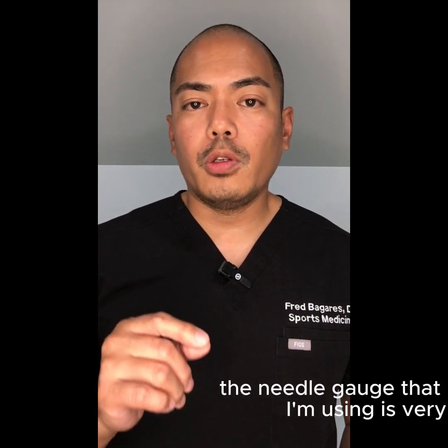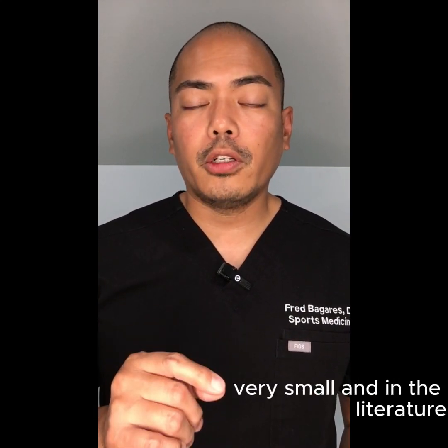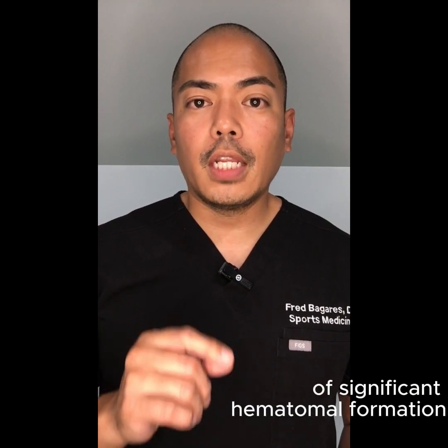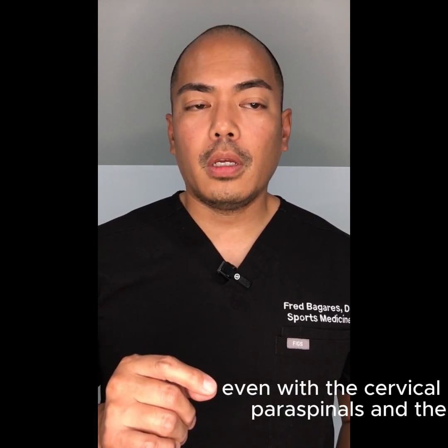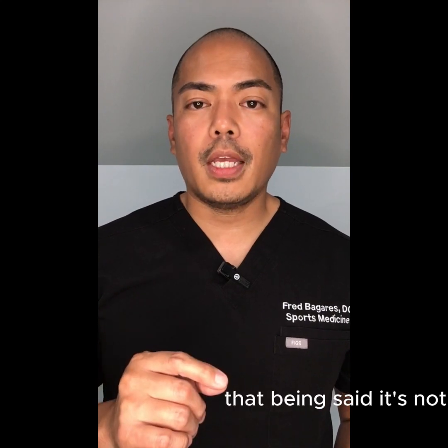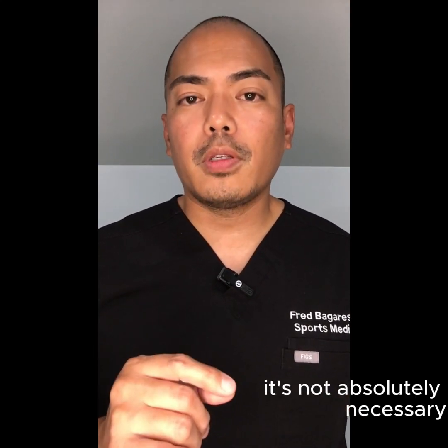The needle gauge that I'm using is very, very small, and in the literature, there are almost no cases of significant hematoma formation. Even with the cervical paraspinals and the lumbar paraspinals, it's very safe. That being said, it's not absolutely necessary.